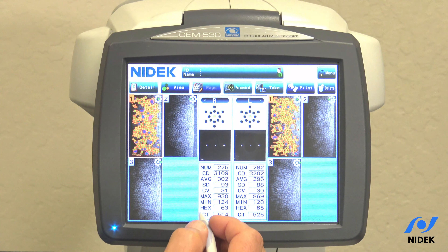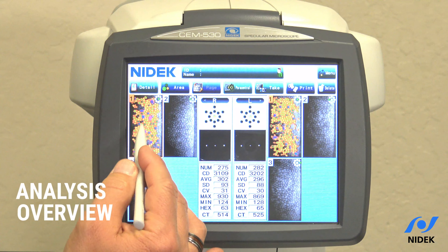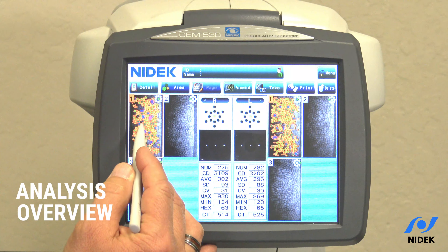Now that we are in the analyze results screen, as you can see here on the right eye, these are the three images that were taken: central, paracentral, paracentral.